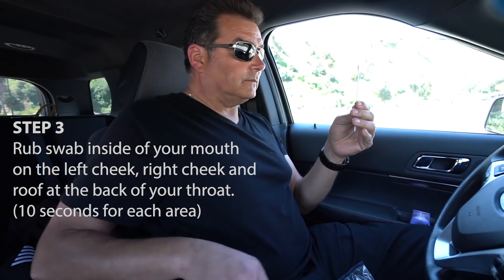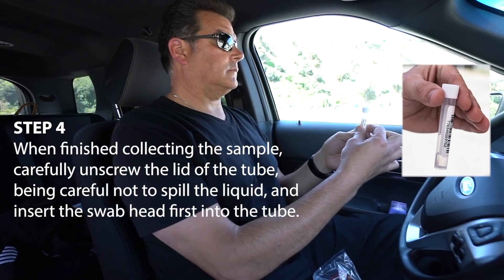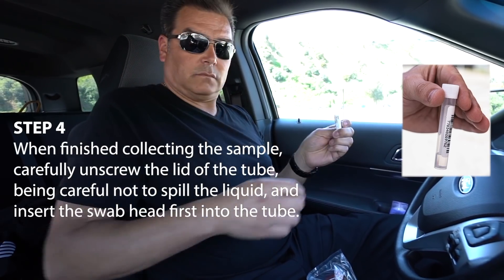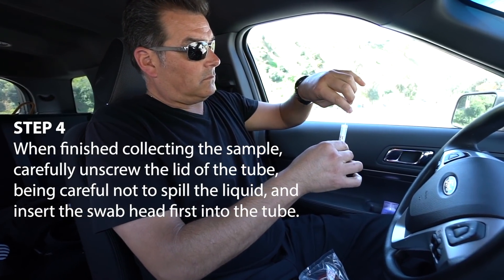Do not touch or place the swab on any other surface. Step 4: When finished collecting the sample, carefully unscrew the lid of the tube, being careful not to spill the liquid, and insert the swab head first into the tube.